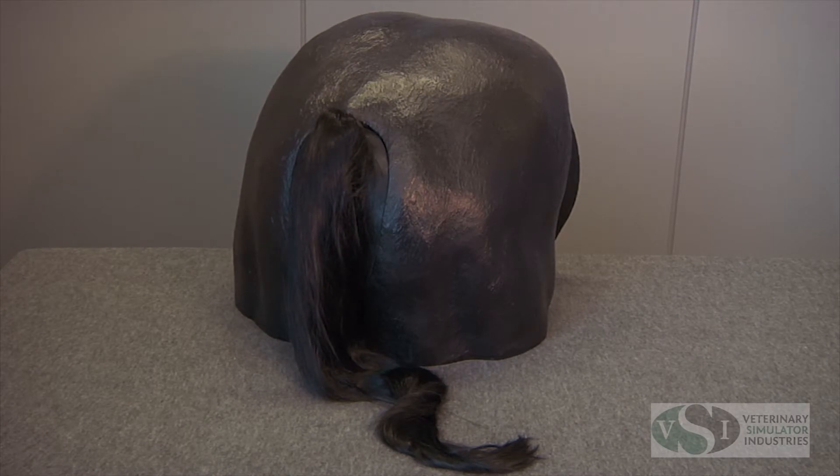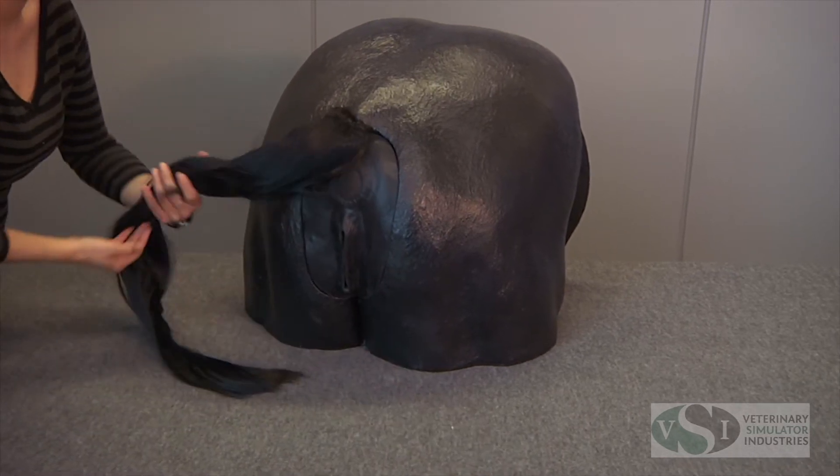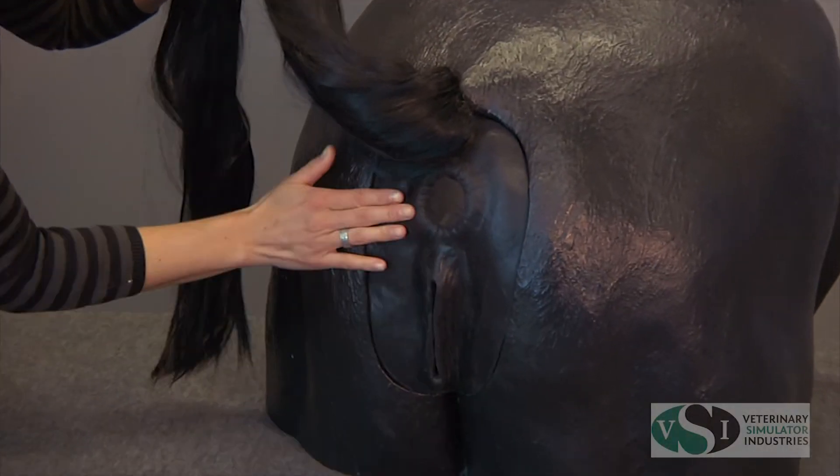The VSI Equine Theriogenology model is made using durable epoxy resin and fiberglass with a flexible silicone perineum panel and uterus and soft natural tail.